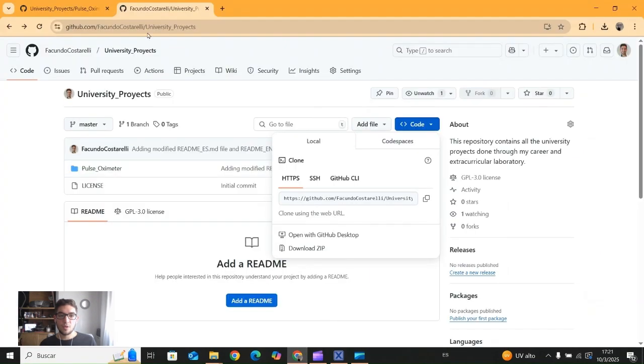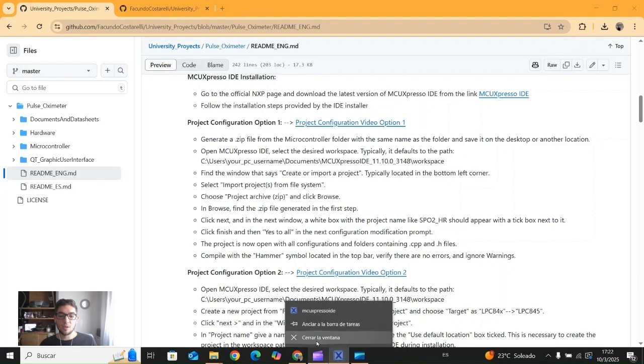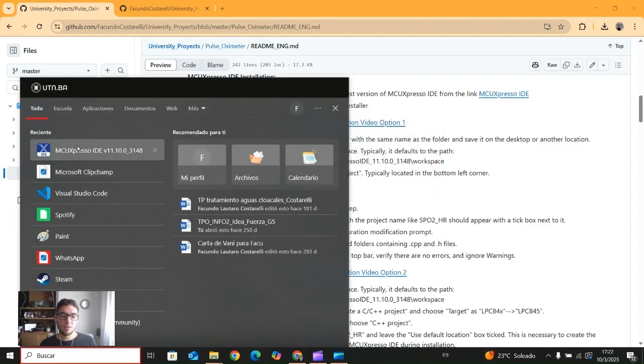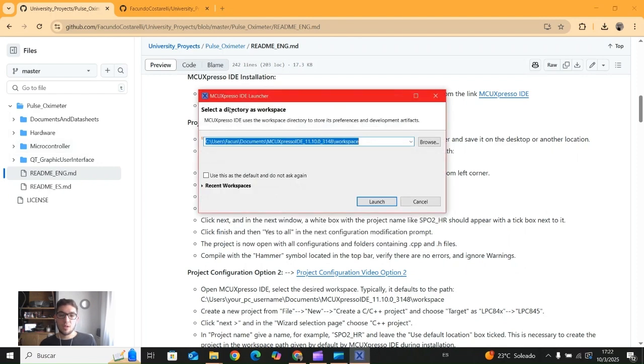Now we need to open the MCUXpresso IDE, and we select the workspace. I have it already opened, but I'm going to close it just for the demonstration. We open it. We wait a few seconds for it to open. Then it asks me for the workspace location.